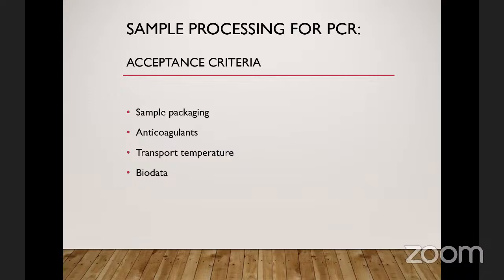Right? And then I pack all of these samples, 10 samples together in the same Ziploc bag. And one of them that is highly positive or positive spills, and then it has access to, even touching the cover of a negative sample. Because of this powerful ability of PCR, or the method that we use in PCR to make several copies, a few copies of DNA that may contaminate a negative sample can make it become positive, and you are going to be having ambiguous results.